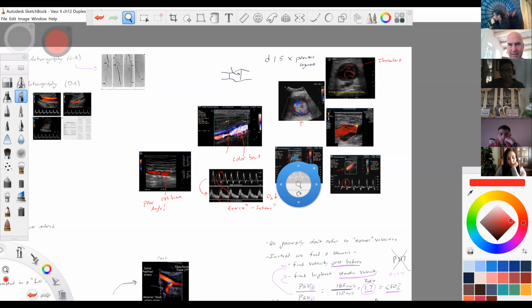There's some clarification. So even the fact that I'm using the word triphasic is questionable. In the case of the leg, it does mean something, but they're actually trying to get away from that because there's a lot of incorrect usage.